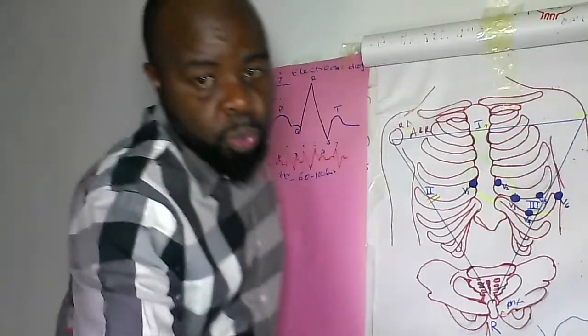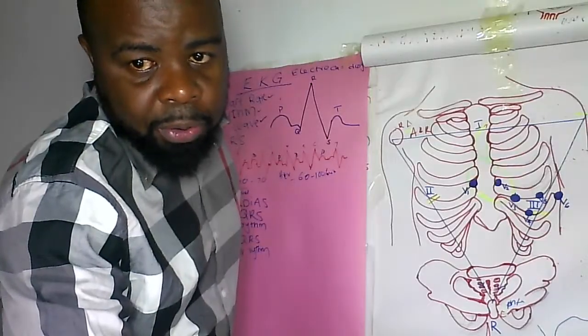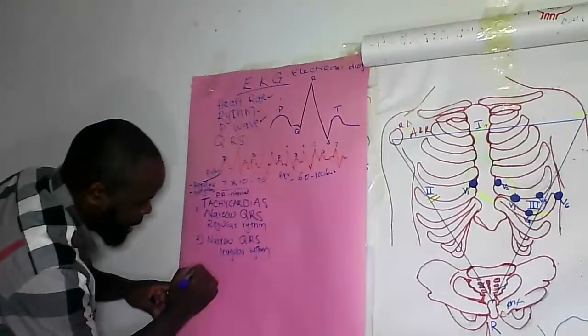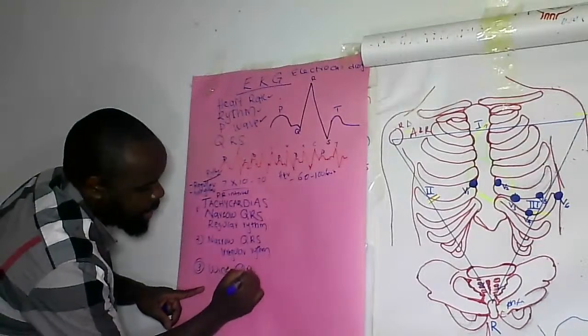And then we have other tachycardias that are very important. These tachycardias are with wide QRS.